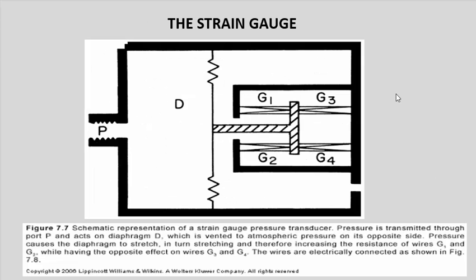So how does a transducer work? This is the last little bit, only a couple of slides to go on this presentation. This is a transducer. It's simply a little magic box with a port connected to the patient via a saline tube, a moving sensitive diaphragm that moves with each heartbeat, and as it moves it moves this plunger across sideways inside a little electrical circuit. And this side of the chamber is dry and vented to air, atmospheric pressure.